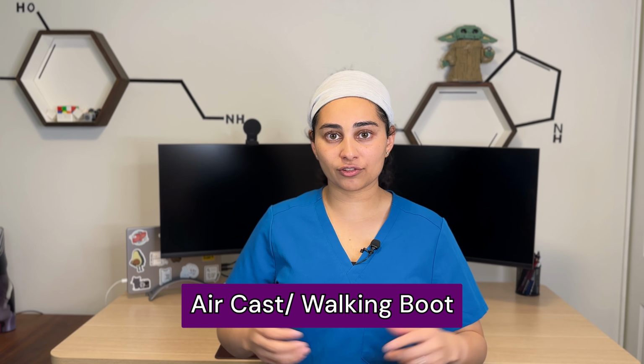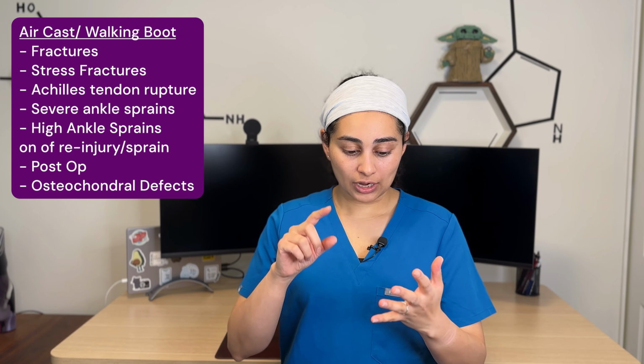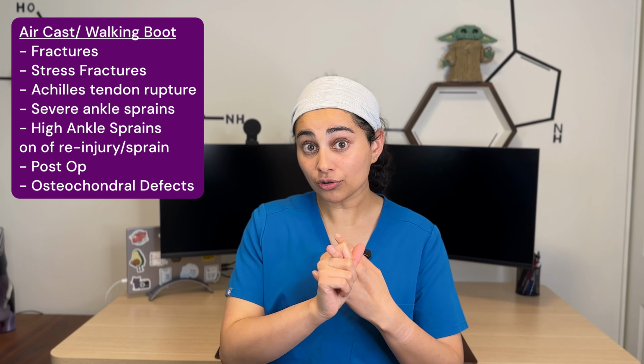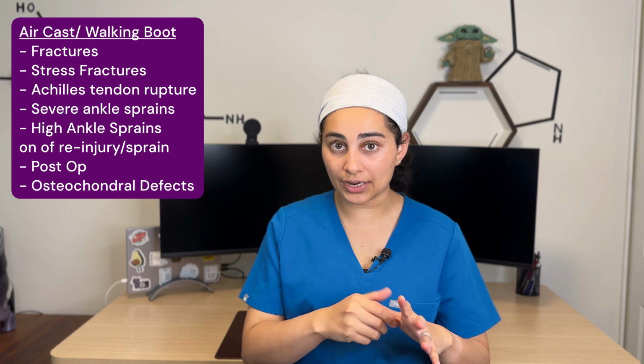So next we have an air cast, which I'll put a picture up to my side here. And how this works is it's going to immobilize the ankle and the foot. And it is used very specifically for more severe injuries. So think about acute fractures, stress fractures, acute Achilles tendon ruptures while you're healing it. You also have severe ligamentous disruption, so a really severe ankle sprain or a high ankle sprain.